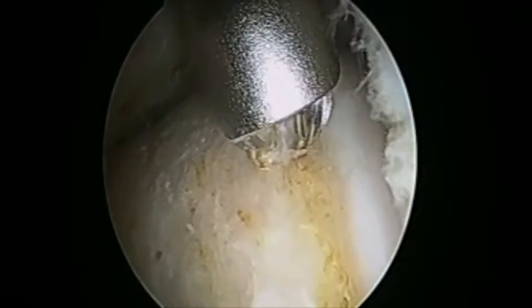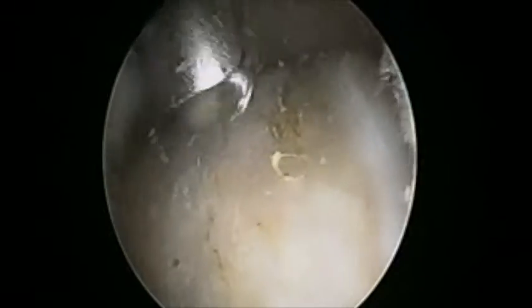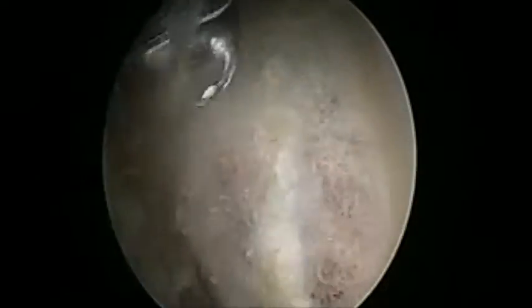To begin, we identify the articular cartilage margin and identify the physeal scar on fluoroscopy, which will be the proximal extent of our resection. With these landmarks identified, the two-tier resection is begun. The Tier 1 resection is begun approximately 1.5 burr lengths distal to the articular cartilage margin.